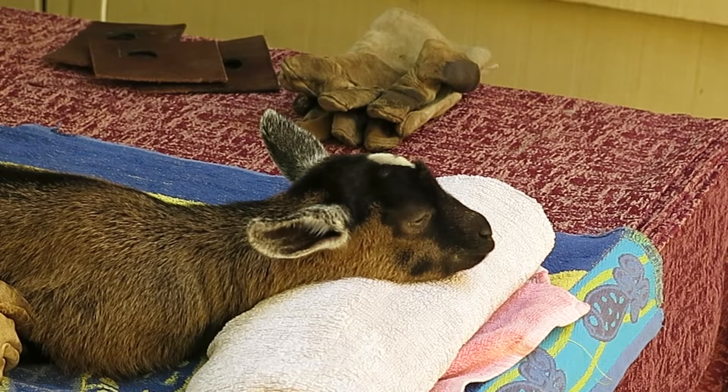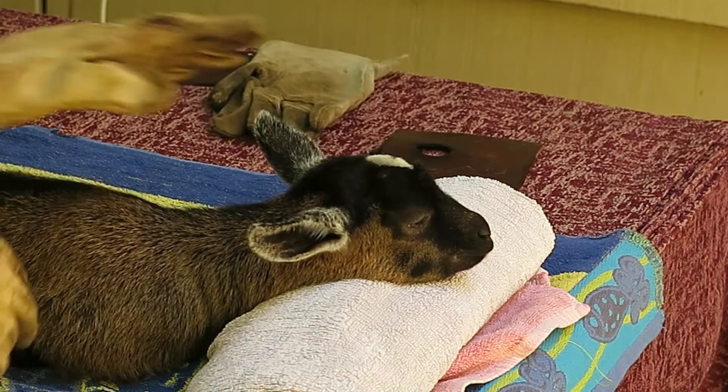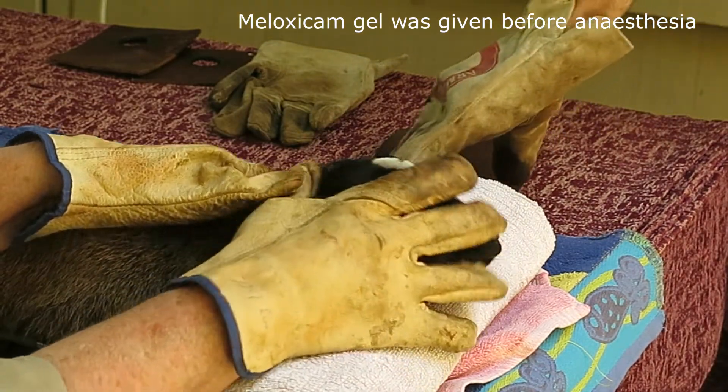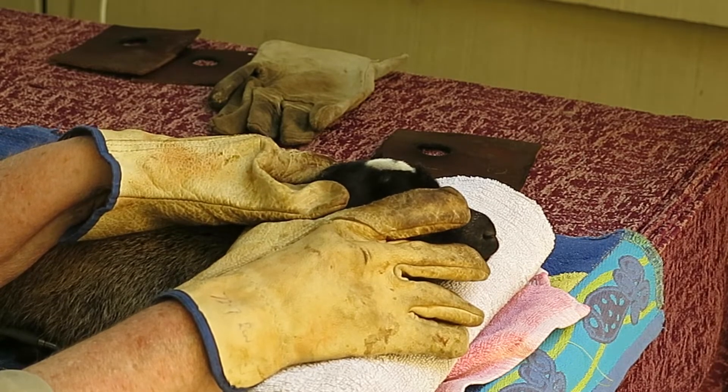This kid has been anaesthetised with Alphaxlone intravenously. I'm monitoring its respiration and heart sounds with a stethoscope.